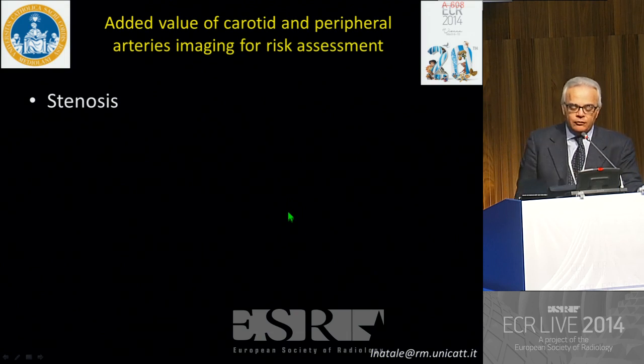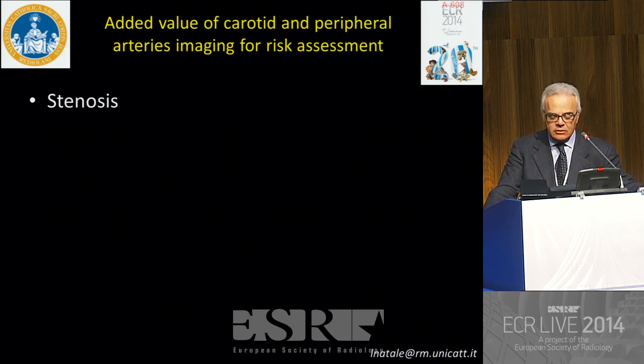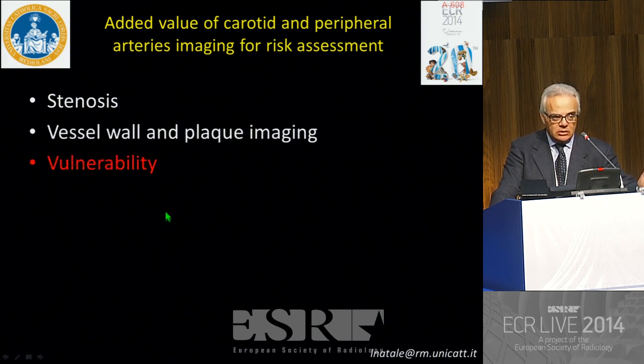So with MR and CT angiography, we can strongly confirm what is known from invasive angiography of peripheral or carotid vessels, but the added value is not to look only at the lumen and quantify the stenosis, but to look at the wall of the artery and characterize the plaque, accepting the well-known concept of vulnerability, where vulnerability is a general concept, not only regarding the vessel wall composition, but also general vulnerability, indicating problems of coagulation and general systemic inflammation and so on.